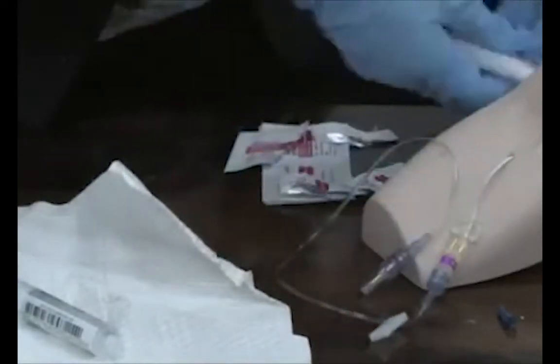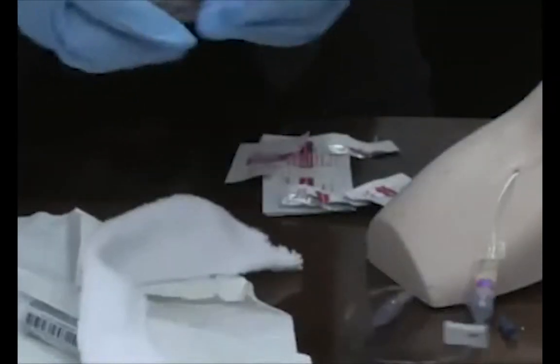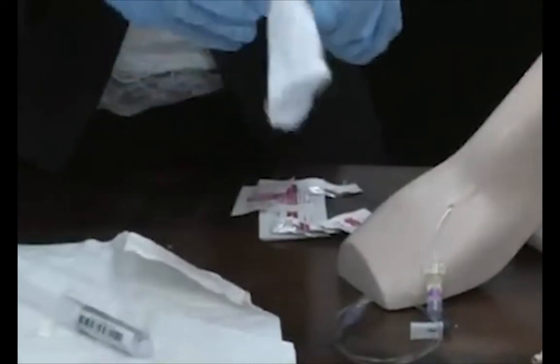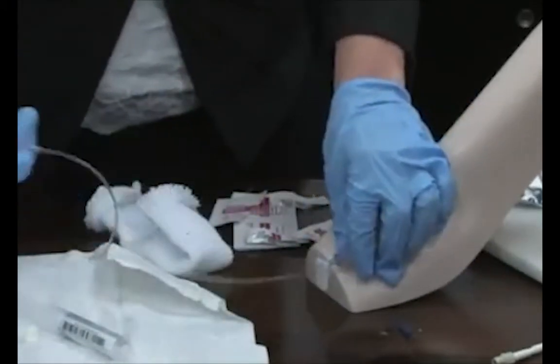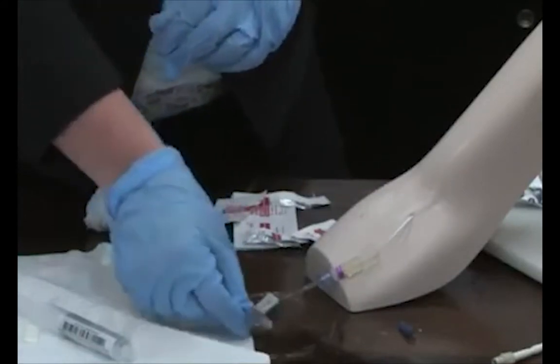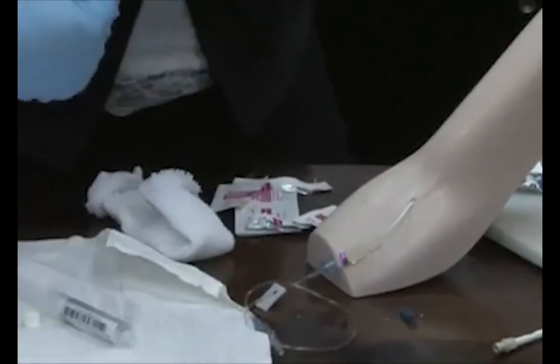And you remove it like this. And this is when you can use something like this. You can roll it up, teach the patients to pull this on. Makes for a very nice, non-restrictive way to keep the extension set in place. This extension set is this length, so we can teach the patients self-care, so they can grab a hold of the end and actually learn to do their own infusion, as opposed to not being able to reach it.